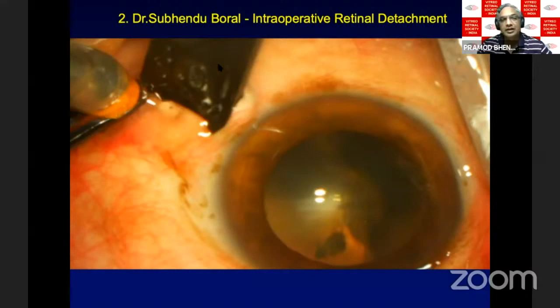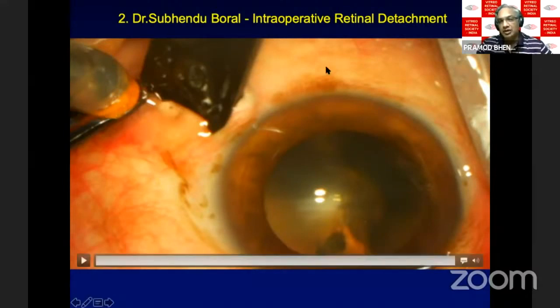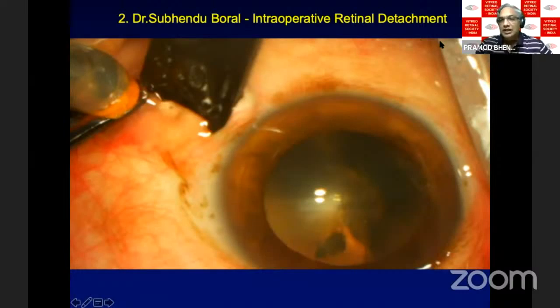That is one. Second thing is, while making the sclerotomy, because you want a self-sealing sclerotomy, you sometimes go too oblique. And while going oblique, you need to make sure your entry should be parallel to the limbus, with slight direction a little bit backward, and because you are going too oblique, the exit may land up far more posterior than the actual entry site outside, and that can lead to this type of complication also.